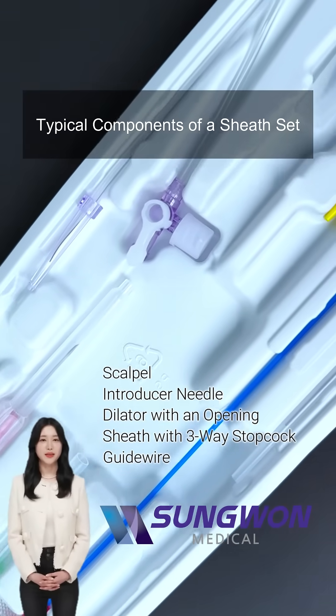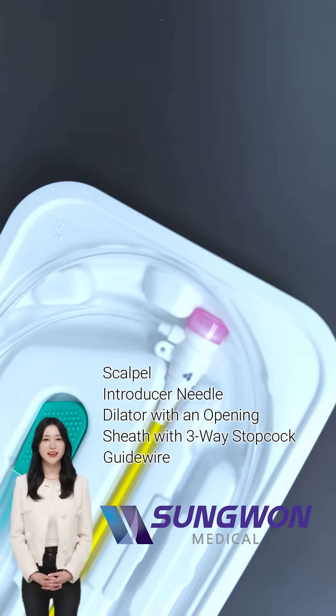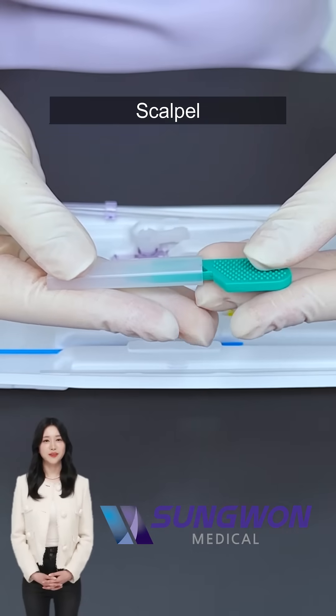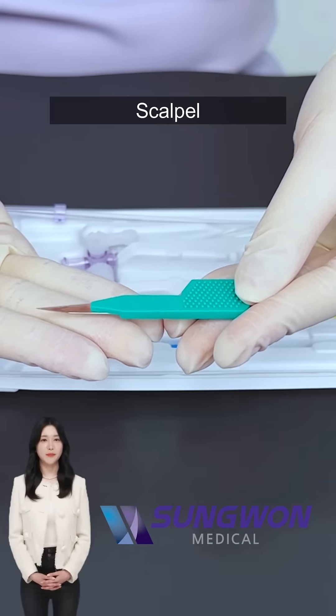The sheath set includes several key items. Let's walk through each component and see how they work together. This helps create a small skin nick or cut before the larger introducer needle goes in, making vascular access easier and reducing tissue trauma.